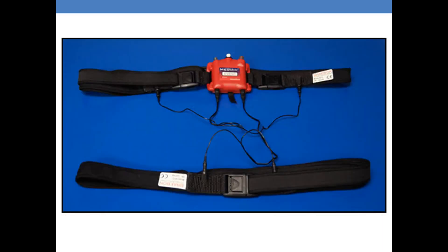This view represents how the two belts are connected. It is highly recommended that you secure the chest belt first, making sure that the belt does not move. Once you have that secured, place the sensors into the belt — you will notice the ports on the underside of the belt. Then fasten the abdomen belt. Once that is secure and snug, place the sensors into those identical ports as you did on the chest belt. You will know the sensors are placed correctly by feeling a little resistance when placing them into the ports.